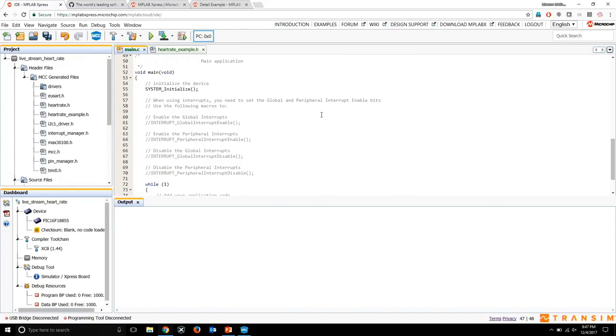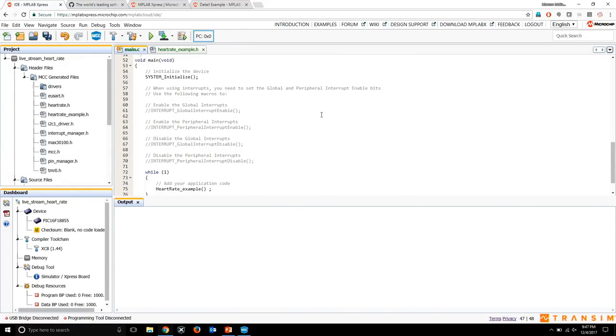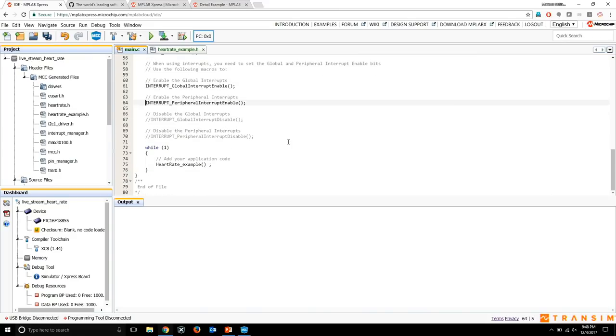Once I have the include done, remember we set up the interrupt for the timer. To make the interrupts work, we're just going to enable the global interrupt and the peripheral interrupt for the timer. We're just going to uncomment these two lines, and it should be good to go. The whole reason, once again, is that this is a template MCC gave us, code that we may or may not be able to use. So this is what it is. It's good to go.